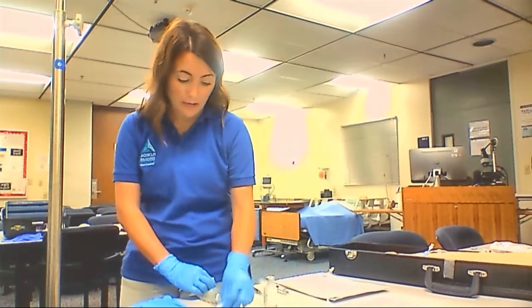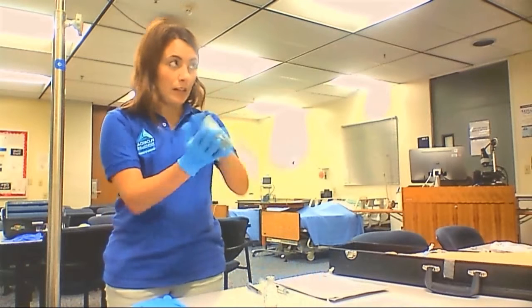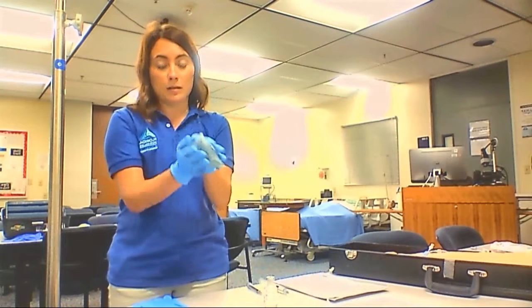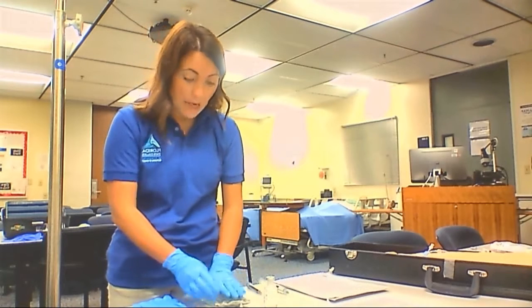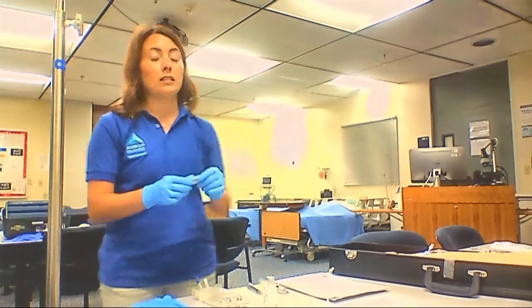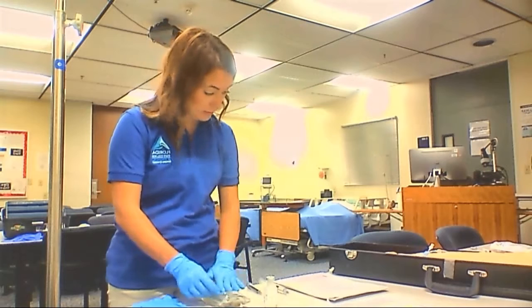And then now I can go ahead and mix this back and forth, like so. I'm not going to shake it because I don't want to create air bubbles. After that, I'm going to go ahead and label this with the patient's name, the drug, the dosage, time of administration, and my initials. So go ahead and have that medication label placed onto the bag.